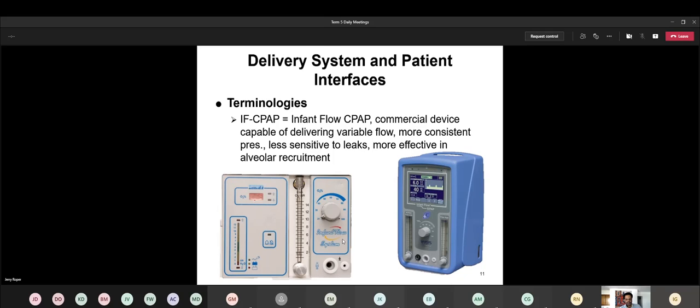And then up here, it shows your FiO2. And again, whatever this is pointing to may not be the same number here, because this has an internal O2 sensor that is measuring the FiO2. So if this is turned to 40, this may say 36. And you go with this. This is what you're documenting, not this, but this.